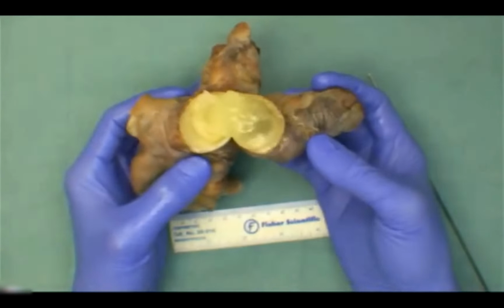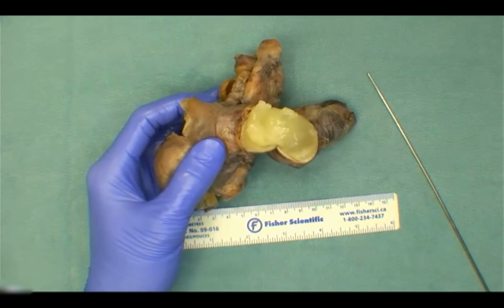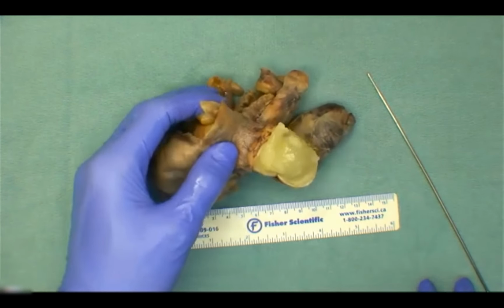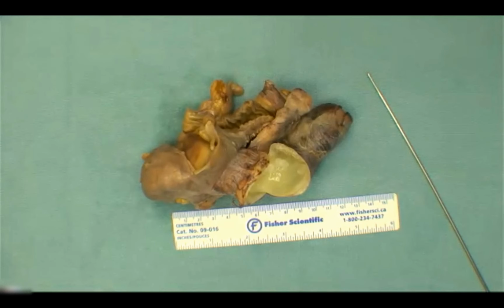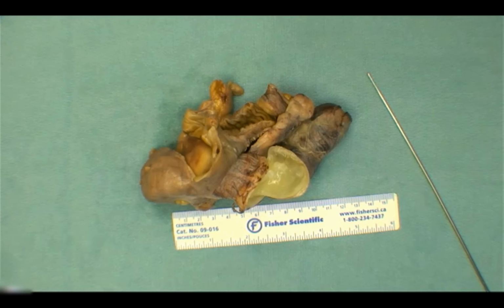And again, why are defects important? Good, exactly. So possible intraperitoneal spread, an extension into abdominal cavity. And I think going back to the one point about inking, that's why we want to ink these specimens ahead of time so that we can evaluate the outer surfaces. Okay, we're just going to launch this poll because people were getting to some of the possible etiologies, but which of the following is not a typical cause for an appendiceal mucocele? It's a spread.